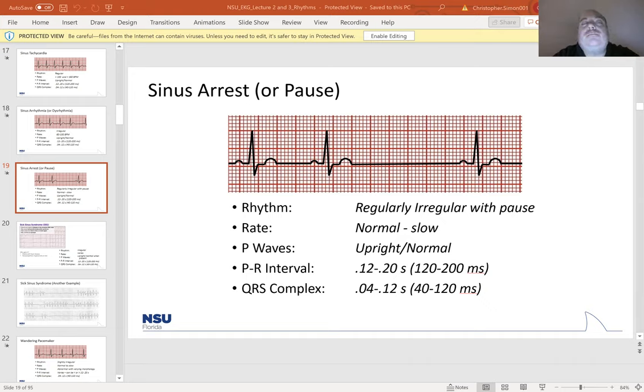Once we finish all that up, we will also look at just an introduction to the 12 lead. We're not going to get into 12 leads just yet. But the thing about it is we have to know what leads look at, what viewpoints of the heart, to move forward. So for example, we're going to talk about identifying WPW today. And there's two different types of WPW, type A, type B. And you have to look in lead V1, for example, for one of the criteria, but we haven't really talked about what leads are what, like V1, V2, V3. I mean, you've heard of them, but we haven't really talked about what looks at what yet.